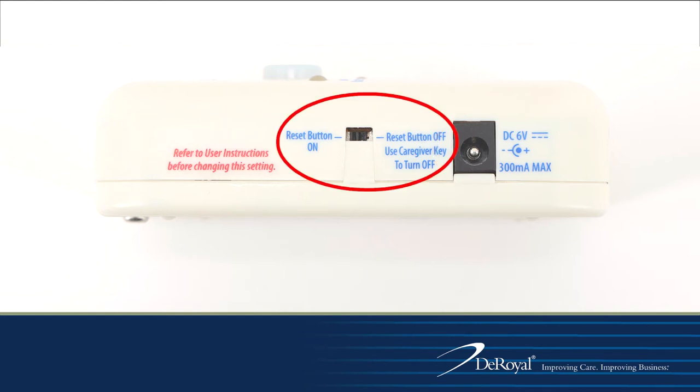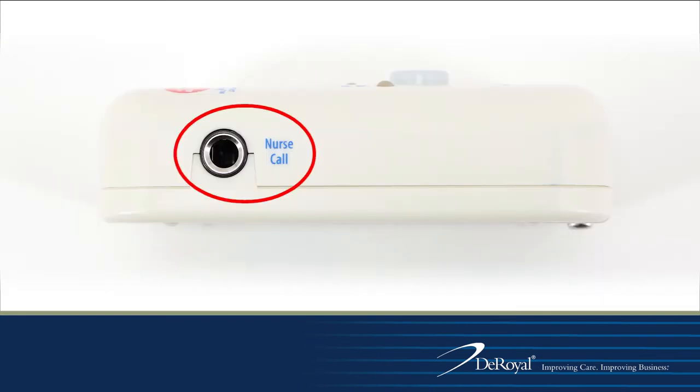The caregiver key toggle option is located directly above the AC adapter port. The nurse call cord port is located on the right side of the monitor and is to be used in conjunction with the DeRoyal nurse call cord. This will link the DeRoyal fall alarm to the hospital's nurse call system.